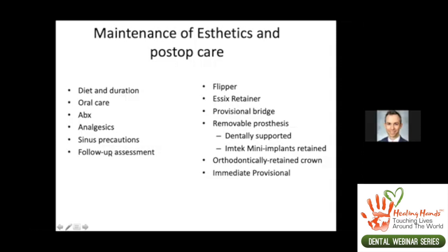All the sutures are resorbable, but you can certainly use non-resorbable sutures and remove them. Also, all the collagen membranes that I typically use are resorbable, so they're typically reabsorbed by the body by the time I'm going back in to place an implant.